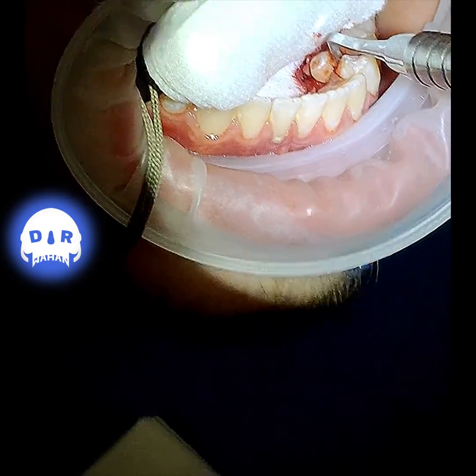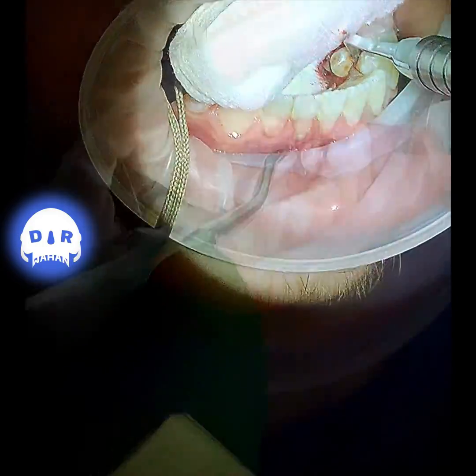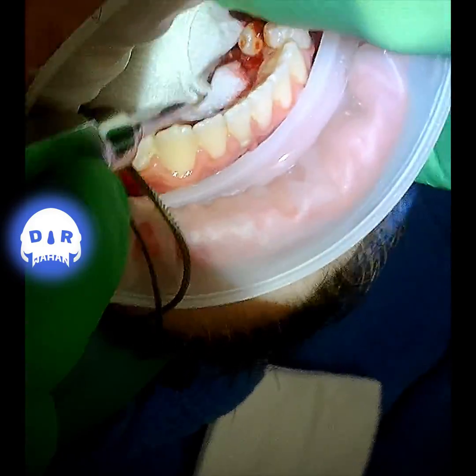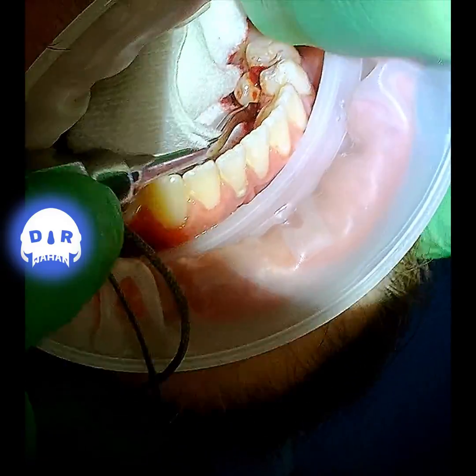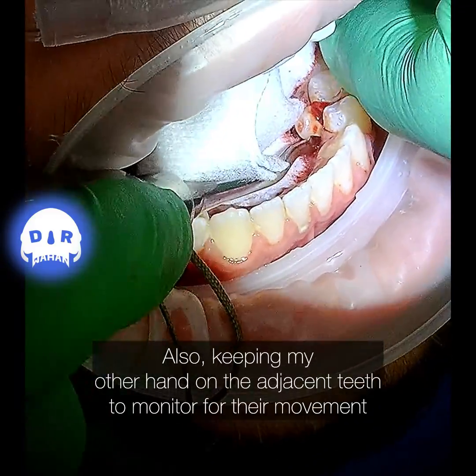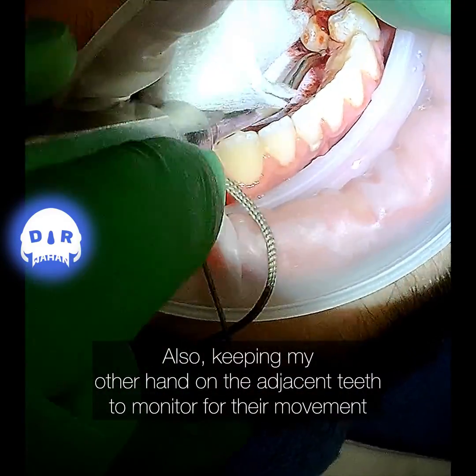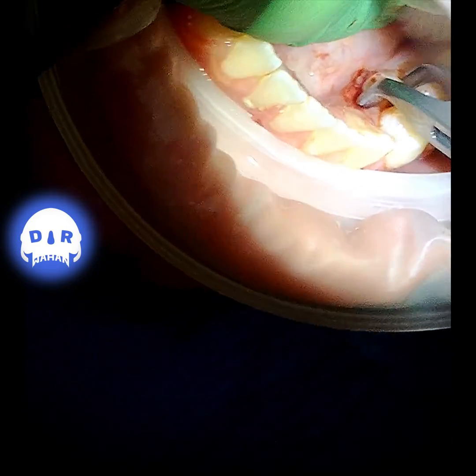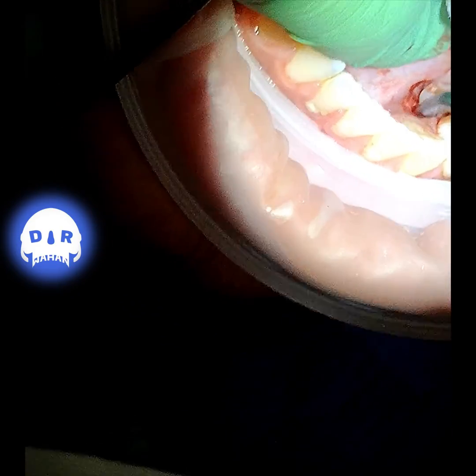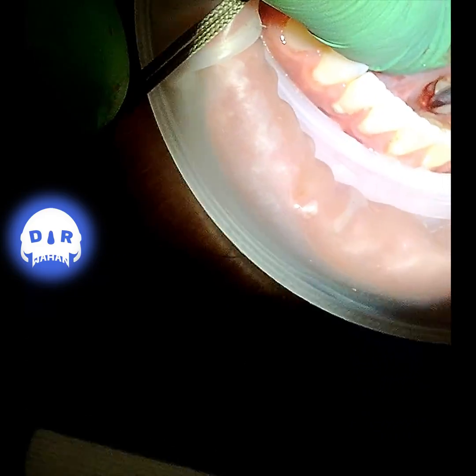There's one last little spot up here, and then I can try to get it out. I'm putting the spade back in now just to give it a last couple of wiggles to gauge how much movement I have — and it looks good. So now I'm ready for the small rongeur to hopefully grab this and get it out. You can still break the end of the root off even when it's this loose, so I'm just taking my time, because if that happens it's pretty difficult to find that fragment.